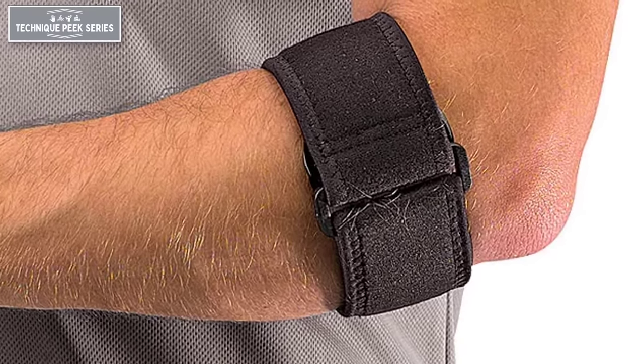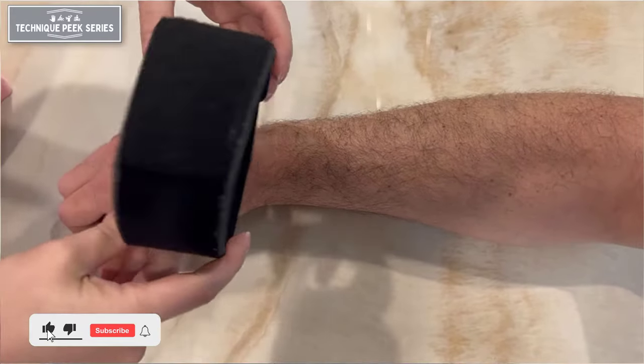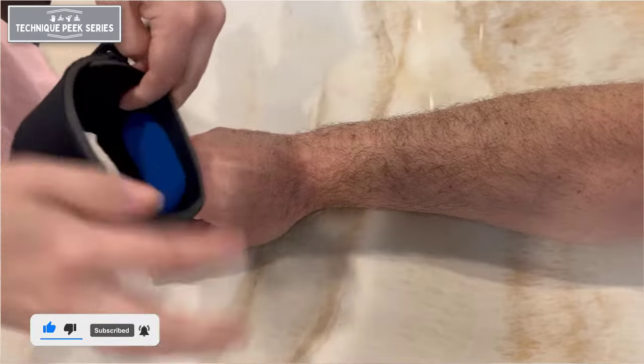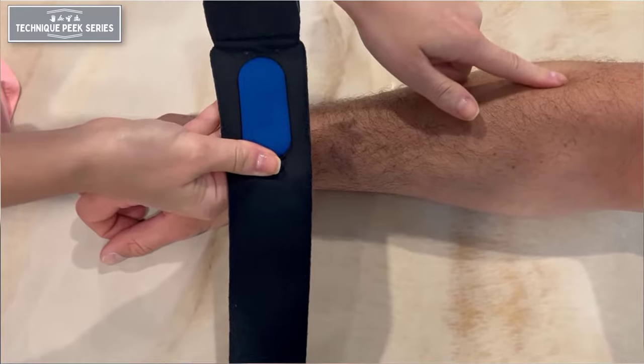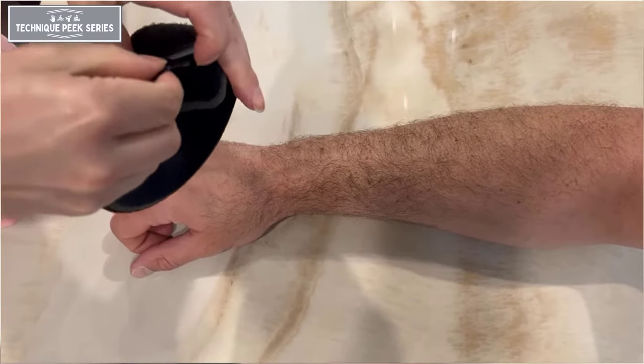Today's Technique Peek will show how to properly put on a tennis elbow band. Tennis elbow bands can be helpful in the phase of therapy where patients are returning to their previous activities. Also known as a counterforce brace, this brace helps redirect the force of the wrist extensors away from their insertion on the lateral epicondyle.